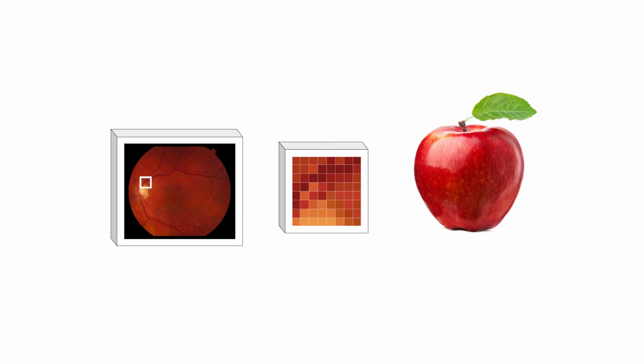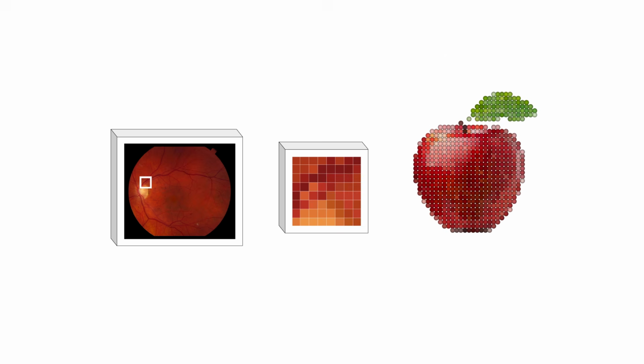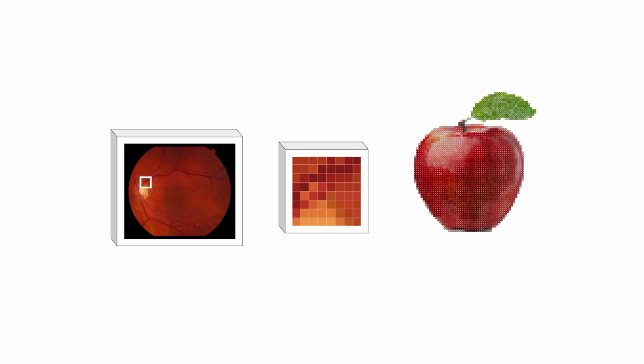But what does this look like for actual images like identifying diabetic retinopathy from an ocular photograph? Images are made out of pixels rather than letters. In a digital context, a pixel is the smallest controllable unit of an image represented on a display. Each pixel is a representation of a tiny portion of the original image. Think about pixels like creating a drawing with dots where every dot has a color value and an intensity. The more dots used, the clearer the image becomes.